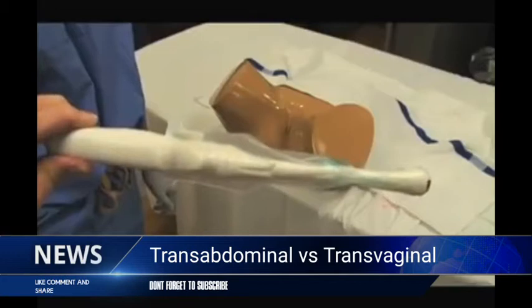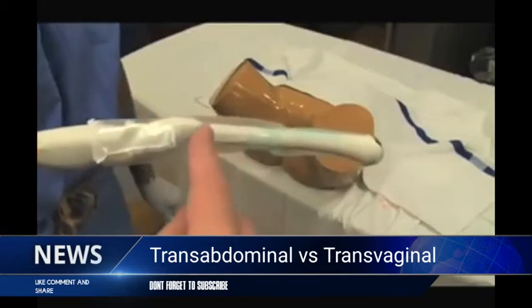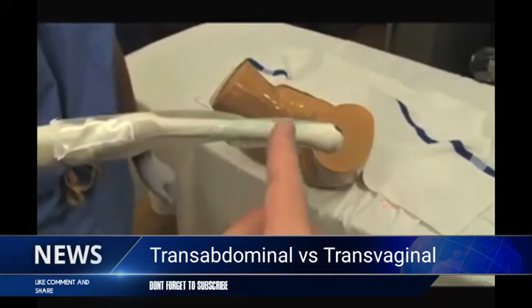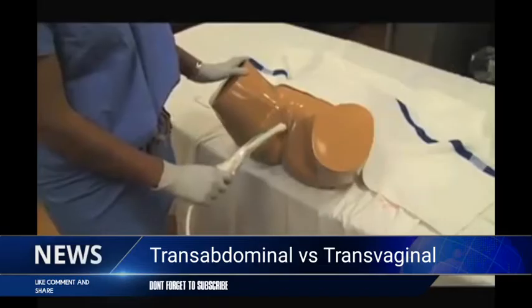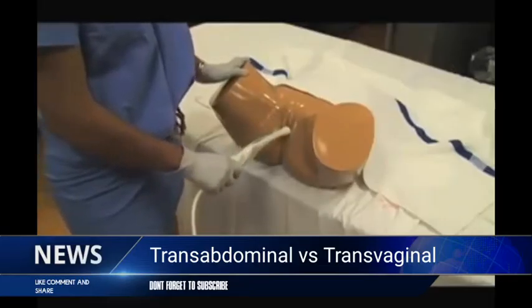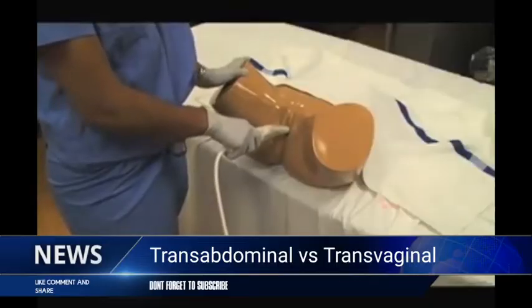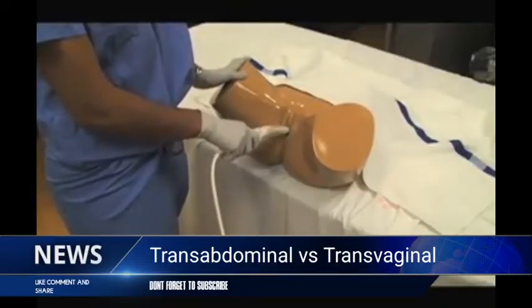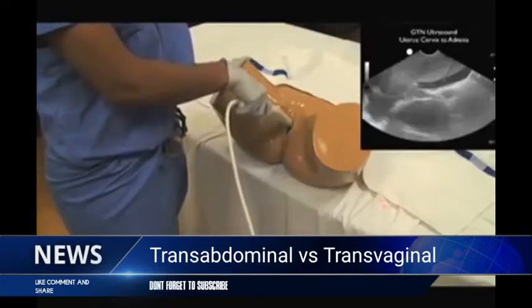Notice we also have a sheath on the probe, and that's standard for GYN sonography. Remember that the probe must be thoroughly cleaned in between different patients as well. We'll begin here by inserting the probe in a long axis configuration. Notice here the probe marker is now towards the ceiling. We're using some simulation equipment here that allows us to simulate using GYN phantoms for ultrasonography.